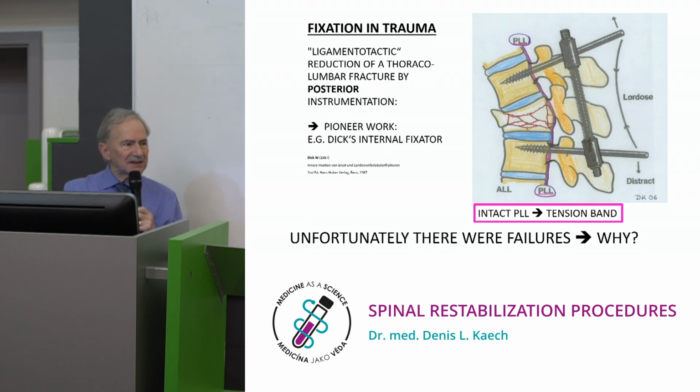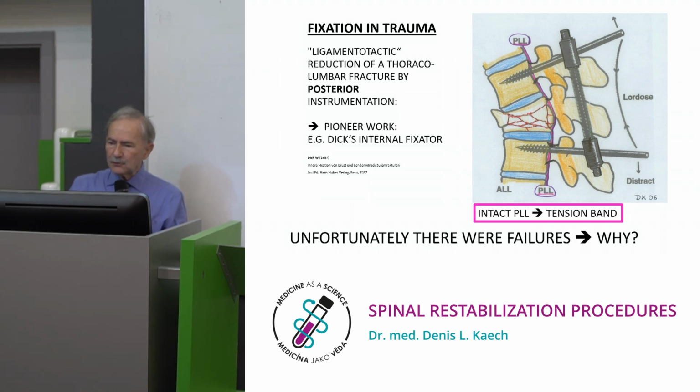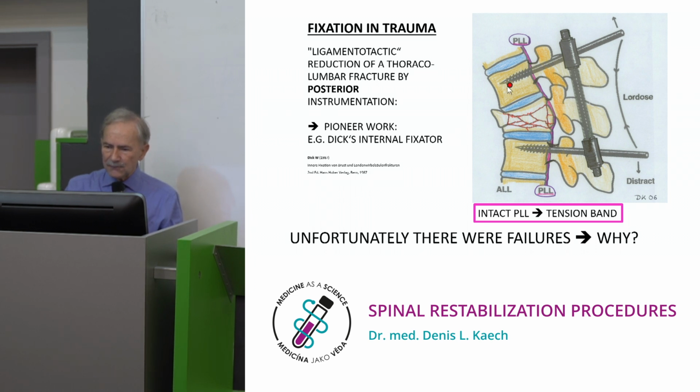Now, basically, what can we do? Walter Dick from Basel, Switzerland, made pioneering work with the internal fixator. You see here a fracture. You insert pedicle screws left and right.